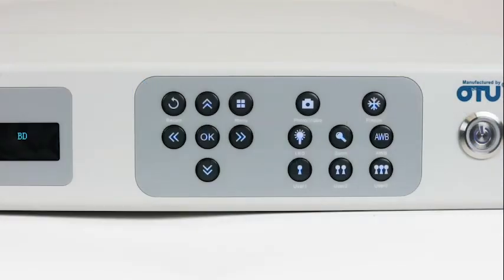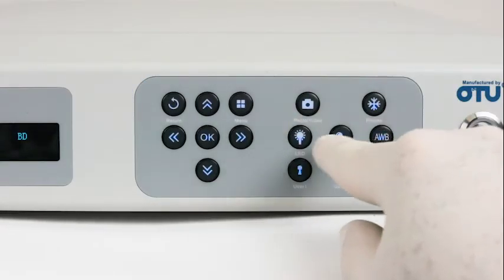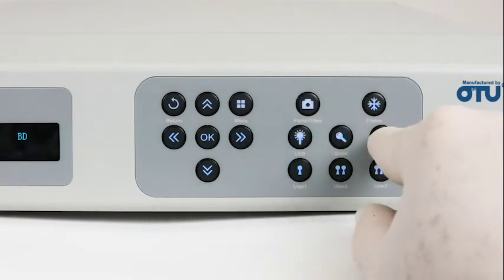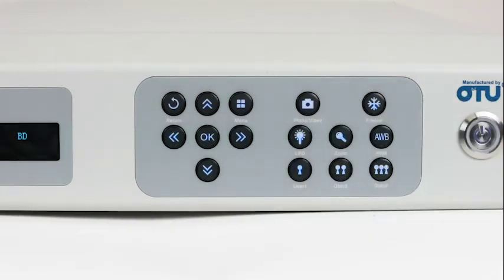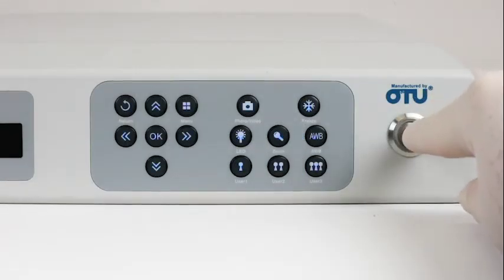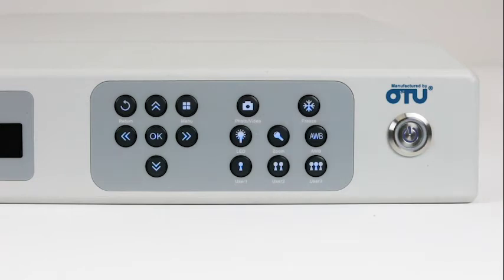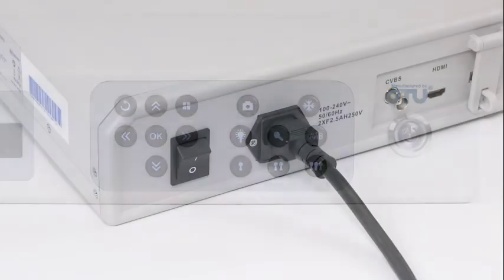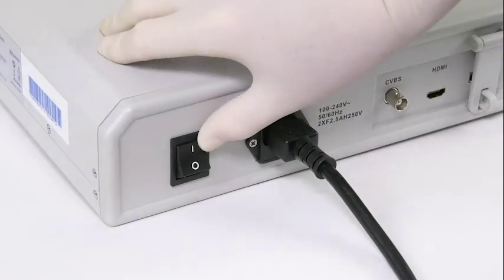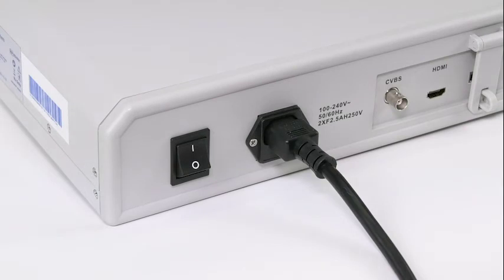The function keys allow for manual adjustment of brightness, zoom, image freeze, photo and video capture, and white balance of an image displayed on the monitor or computer screen. There is also the switch between standby mode and working mode. By pressing the standby/working mode switch, the system is put into working mode. A blue indicator light signals when the switch is on. If there is no light emitted when the switch is pressed, the main supply switch in the back needs to be turned to the on position.